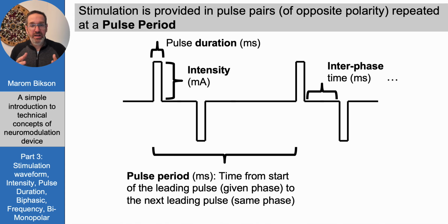Simpler math, imagine there's 1 second between each couplet, right? We will now say that we're stimulating at 1 hertz. Once per second, we have a couplet. Now, if you're thinking about it, you'll realize that there's actually double the amount of pulses, right? So if we're doing a couplet every second, then in fact, every second there are 2 pulses, one going in and out.